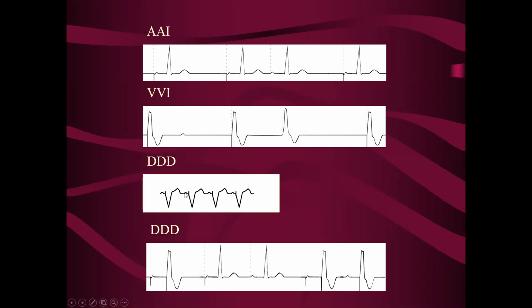So remember when I said that it depends on which chamber, so the dual response is inhibit or trigger pacing. When it sees a P wave, it's going to sense the P wave and time out the PR interval. If there's no intrinsic conduction, the pacemaker is going to trigger a ventricular pacing impulse in response to that sensed P wave. So that's where the trigger comes from. But sensing that P wave also inhibits the atrial pacing, right? It recognizes that the P wave came through and therefore it won't pace in the atrium. So that's where the inhibit response is as well.